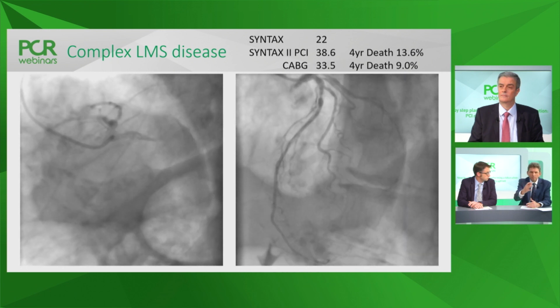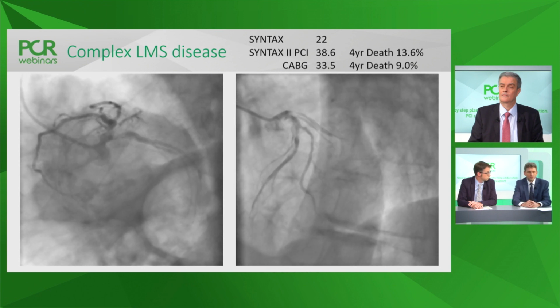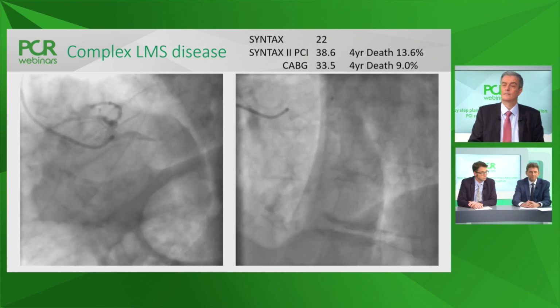And given a bunch of calcium, what you see on the image, I think that 2-stent strategy will be necessary with this patient. Tom, what were your considerations when you looked at these angios? You had a heart team, I guess. What was the discussion and what did you decide?